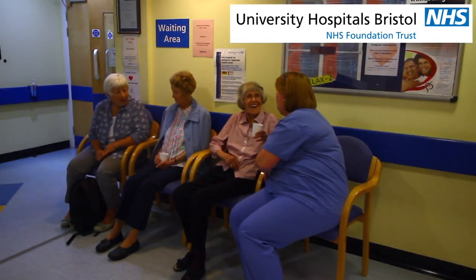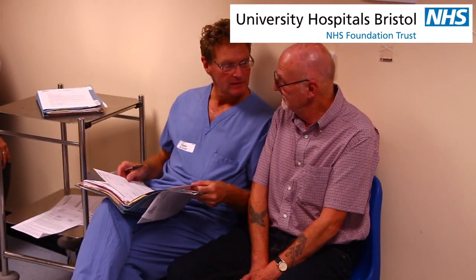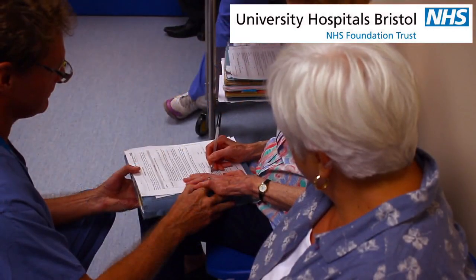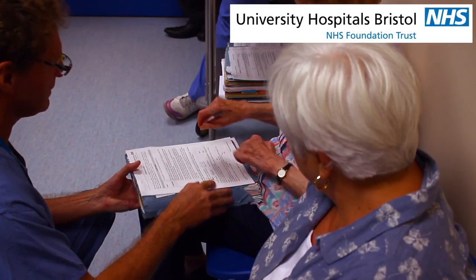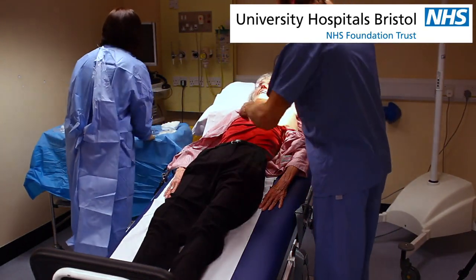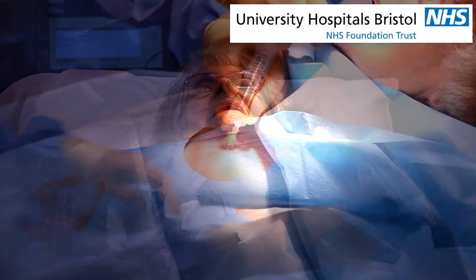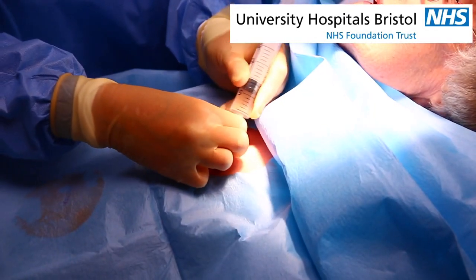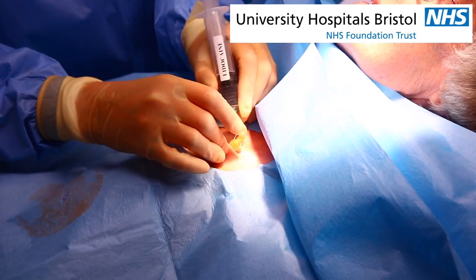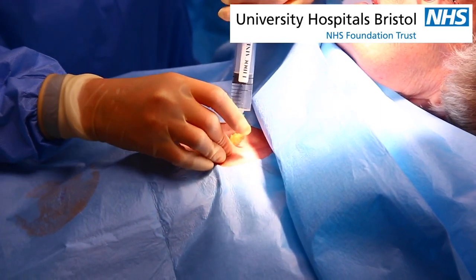When you arrive at your appointment, you will be met by a member of staff who will answer any additional questions you may have. If you are happy to proceed, they will ask you to give your agreement for the procedure to go ahead. You will be asked to remove your shirt and to lie on the examination couch. Your skin will then be thoroughly cleaned. The person performing the procedure will inject some local anaesthetic into the skin. This may sting at first but should then become completely numb. We will check that it is numb before proceeding any further.